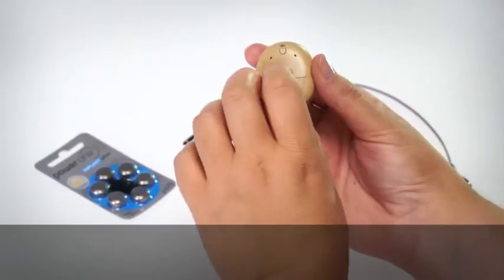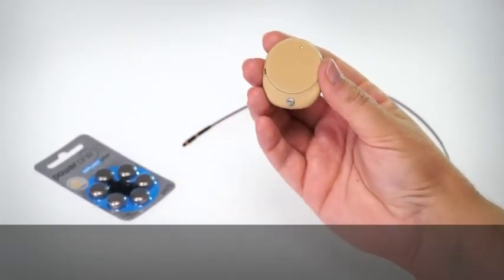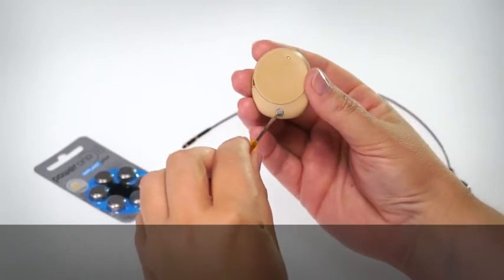If the battery cover is locked, turn the locking screw anti-clockwise to unlock it.